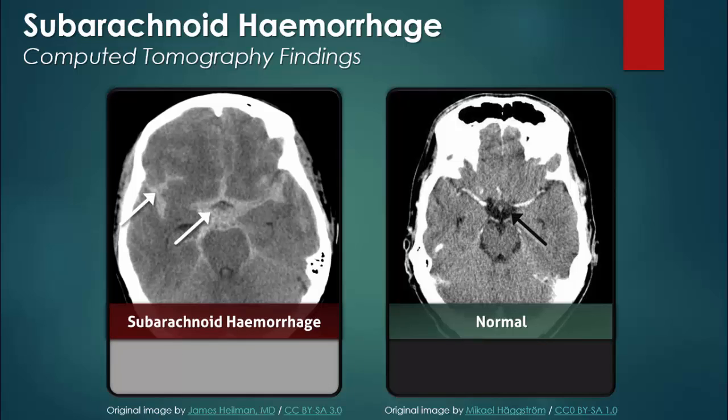So when there is suspicion for a subarachnoid hemorrhage, inspect the non-contrast CT for areas within the subarachnoid space to be a light shade of gray, as opposed to the normal dark gray.